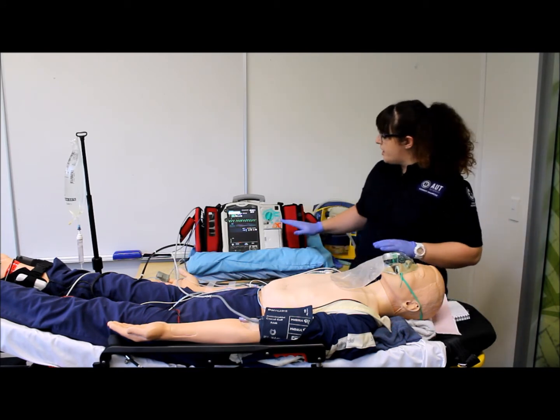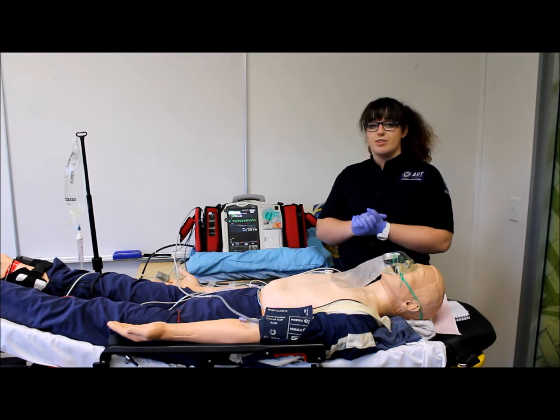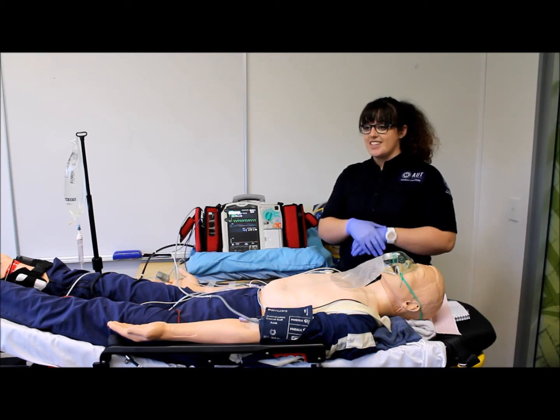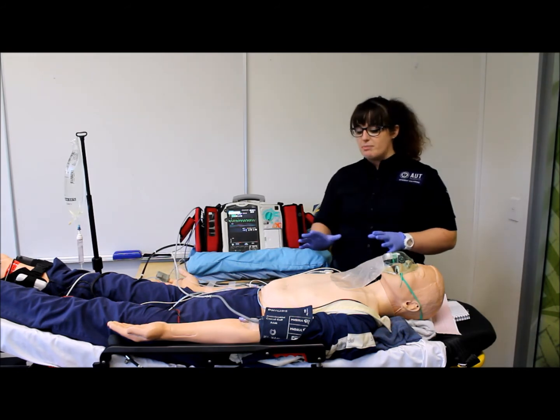So now we have got our pads on. I'm just going to make sure that I'm calling for R50 backup. So AUT1 calls comms. Go ahead, AUT1. Requesting R50 for status 1 VT. Copy, they'll be about 20 minutes away. Copy, thank you. Alright, so we have our pads on.